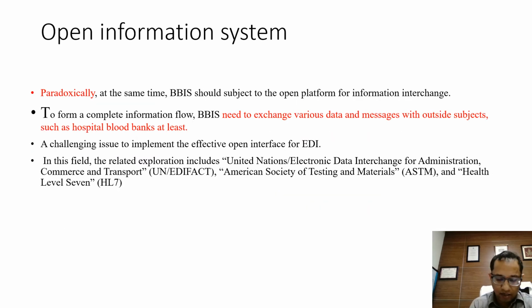Paradoxically, we are saying that it should be a closed system, but it should also have the feature of an open information system, which is that the blood bank information system should be subject to an open platform for information exchange. To form a complete information flow, BBIS needs to exchange various data and messages with outside subjects, such as hospital blood banks at least. A challenging issue in this is having an electronic data interchange.